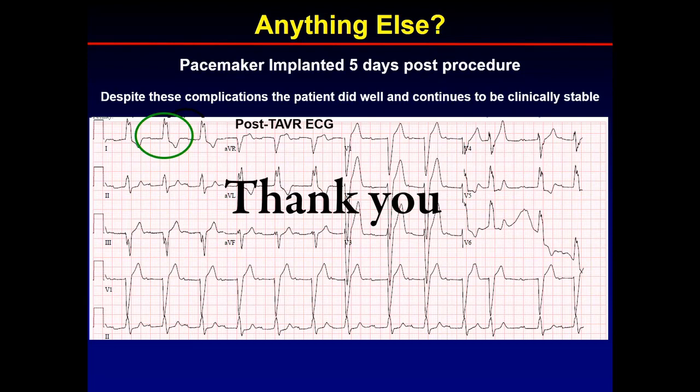I think we have had some experience doing this back in Cleveland and Pittsburgh, just with selected cases. So, as Philipp mentioned, a non-contrast gated CT, and co-register that with a 3D whole heart acquisition. There is a recent paper, a small cohort of patients, from a group at Penn, trying to do it in systolic phase. Acquisition is obviously longer, but they were able to get reproducible measurements too.